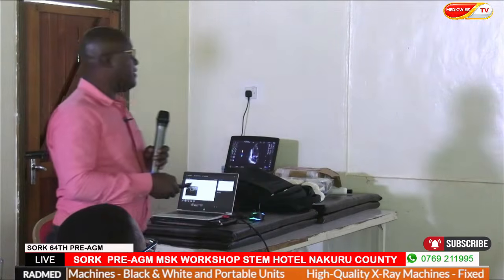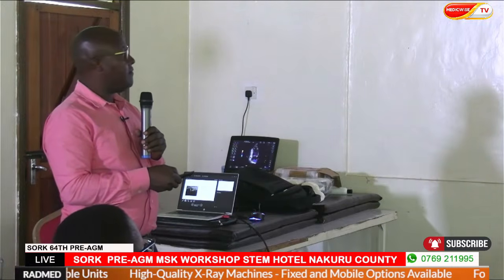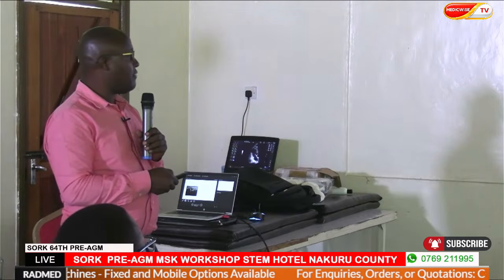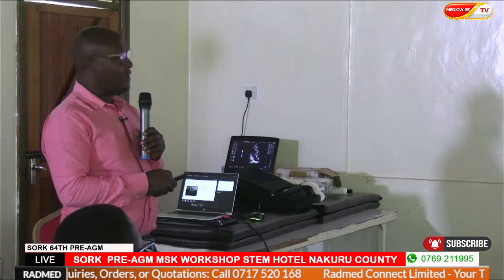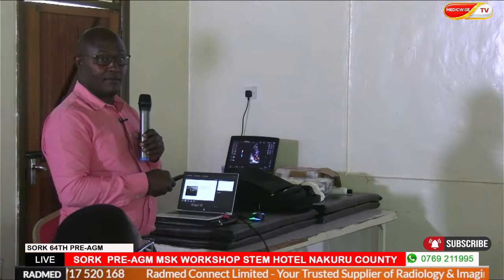And now this is an image of the distal tibiofibular joint, and that is the talofibular ligament. The bone here, the big one, is the tibia, and this one is the fibula. And this one usually is prone to tears. Many times when we walk, you step on uneven ground and you end up twisting your foot like this. And the ligament you are affecting is that.